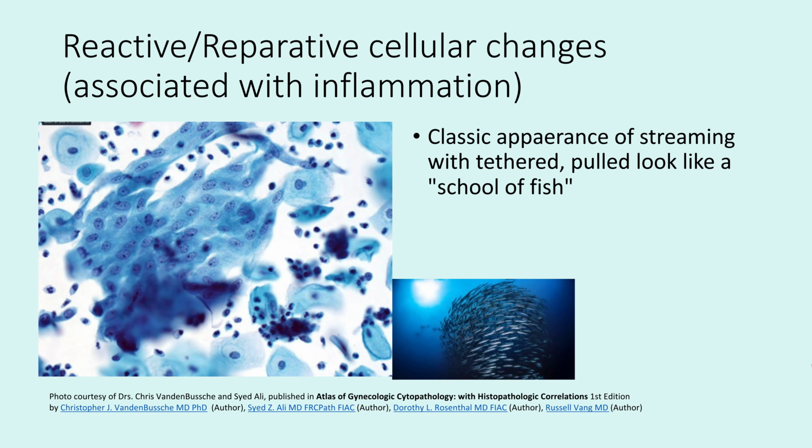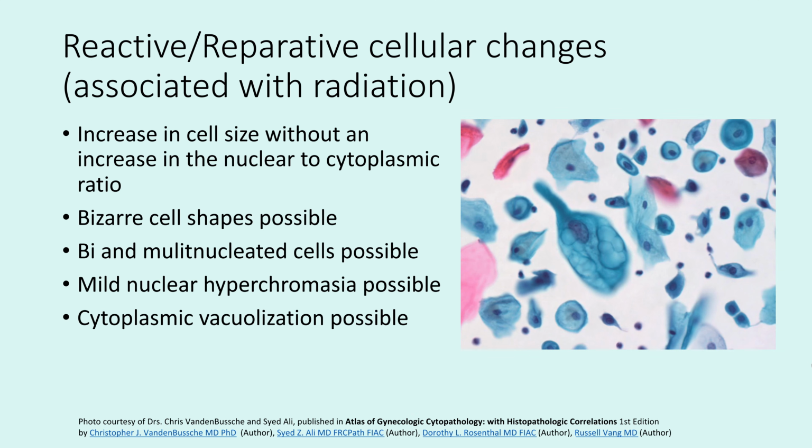And then the classic presentation, for test-taking purposes and in real life, is of a streaming look. So they sort of look like they're tethered on both ends and they're being pulled like a school of fish. Classic appearance. So the next kind of reactive repair is associated with radiation.